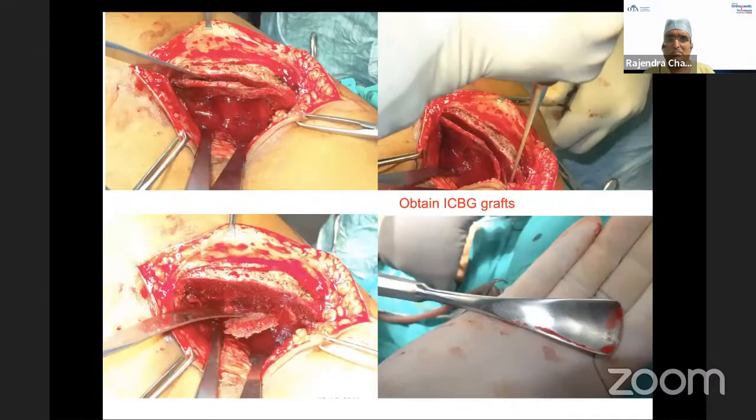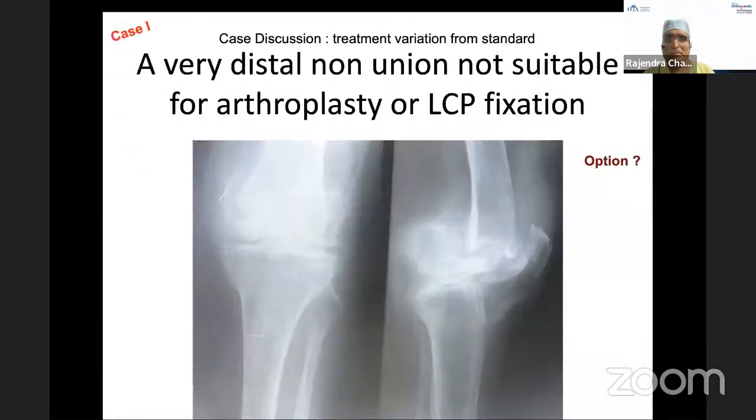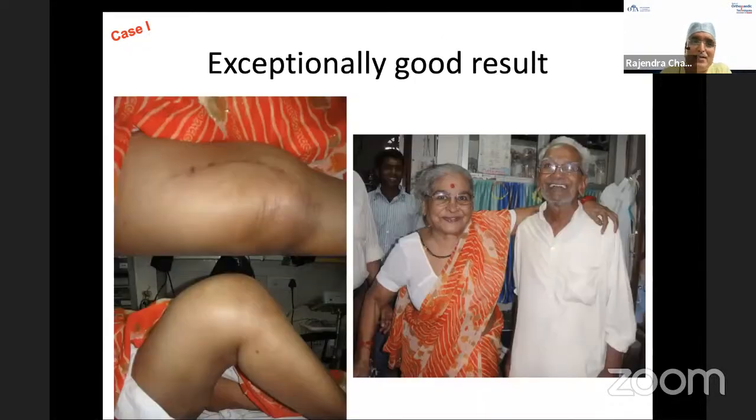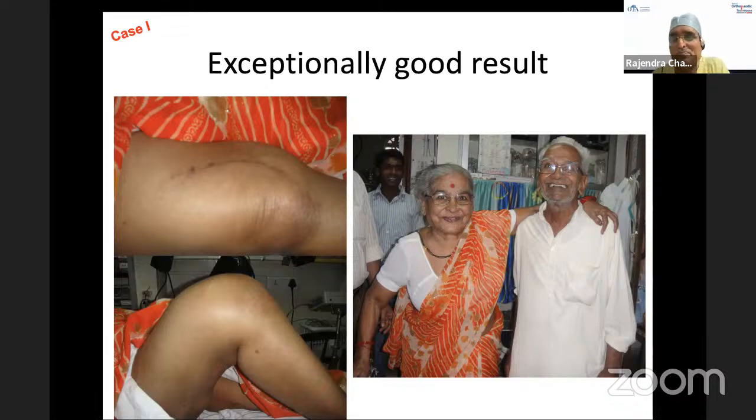So this is just a couple of same fixations. I had presented this slide previously also. Coming to that, sir, I would show the X-ray, and this patient healed completely, because that was the only possible construct. I know this doesn't look good in modern-day orthopedics, but this was in the first few years of 2000. I had no other locking plate construct available and suitable for that. And this patient became completely all right. She was very old. But I understand it's not a construct which I would boast of, and not a construct to be propagated. But that was an exceptional situation where I had to use that.